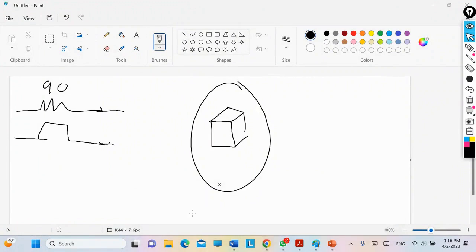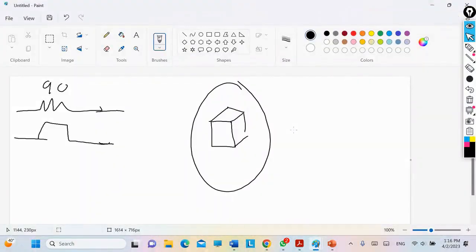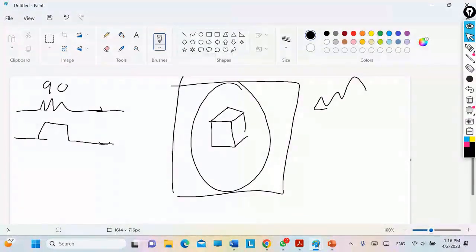The excitation for the slice. Right now I'm giving the RF, and I just want this slice. So, does this slice that I'm going to take here contain my voxel or not? Great. Then, after you do this, you should apply another gradient with another pulse of 180 degrees.